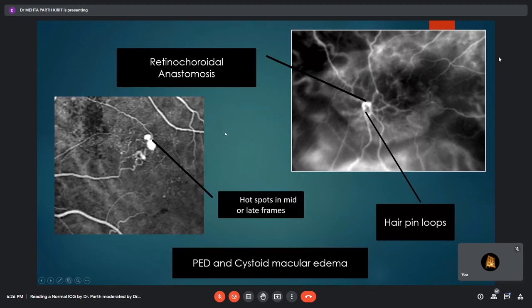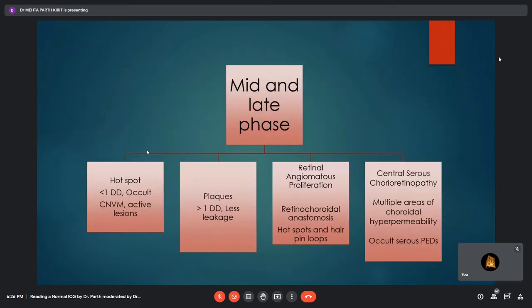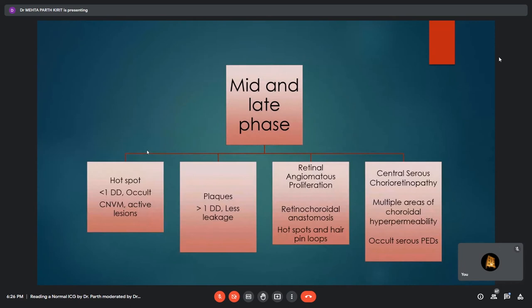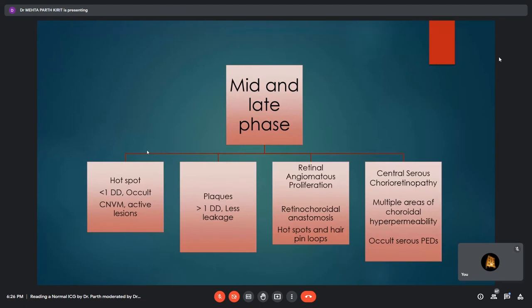Retinal angiomatous proliferation, also known as type 3 CNVM, has characteristic findings on ICGA. It shows hotspots in mid or late frames, which may be associated with pigment epithelial detachment and cystoid macular edema, as well as hairpin loops showing the feeding arteriole and draining venule. ICGA is important to differentiate occult CNVM from RAP: occult CNVM occurs at the edges of the PED whereas RAP occurs within the area of the PED. RAP is more aggressive and less responsive to treatment. Also, in CSCR, smokestack leaks can be seen on ICG, mirroring what is seen on FFA, since CSCR involves choroidal vascular abnormality.